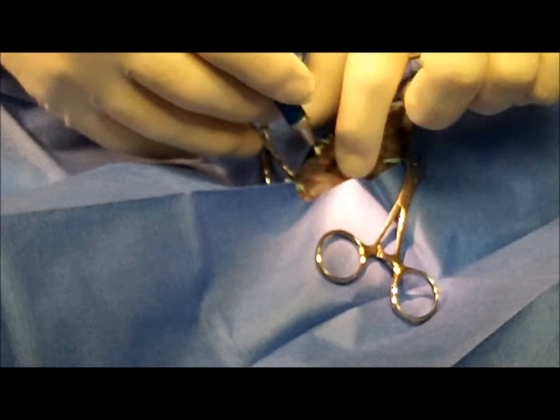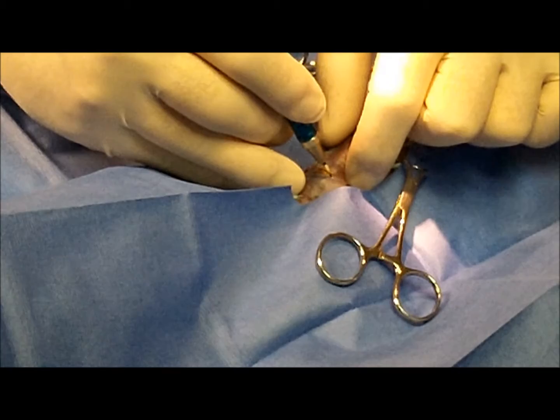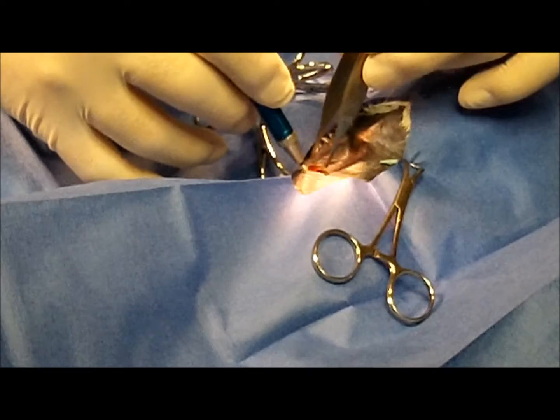I had an assistant put his finger in through the cloaca so we could extend it and I'd know where to cut. I'm cutting right at the cranial portion of the cloaca. We've got a transverse incision with the laser, which works very nicely because there's very little blood.